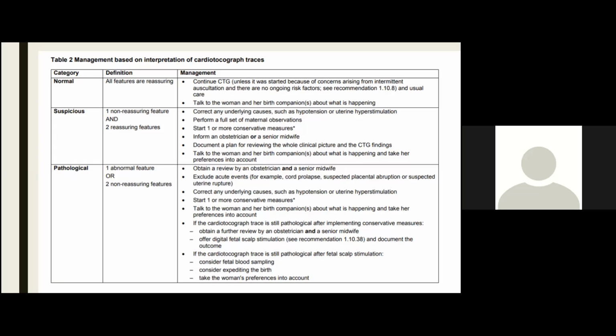Dr. Malick, thank you very much for your lectures and for your time. My question is, in which case could a CTG give a false positive result? Usually at the beginning you say that it's better if a woman doesn't do a CTG, because that's not a good examination to assess this, so I wanted to make clear in which case it should be supported by an echography. And also can the result depend on the operator who is reading the paper and the curve? Because sometimes it could be misleading. In this case, it can be misread.